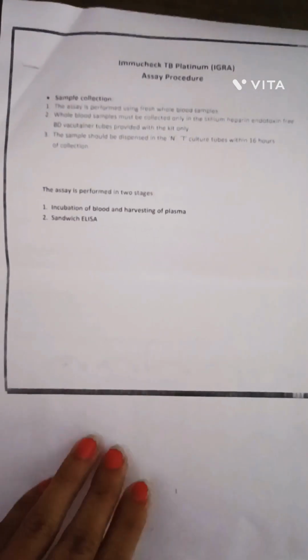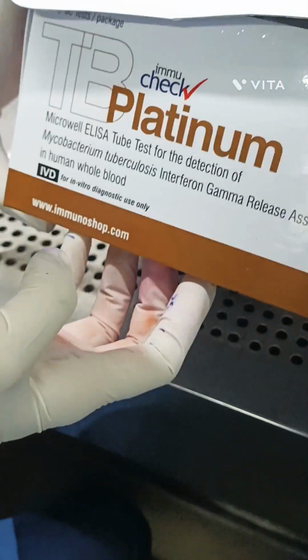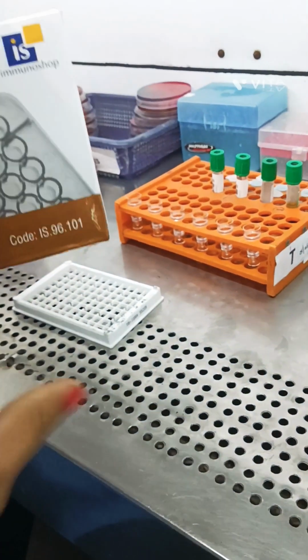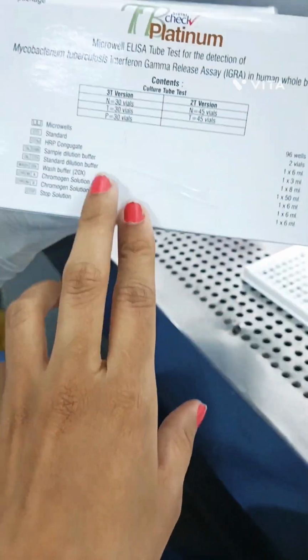So today I will discuss TB Platinum, what is the principle of TB Platinum, assay procedure and interpretation of the results. So what is TB Platinum? TB Platinum is based on the principle of IGRA, interferon gamma release assay. It is quantitative and checks for TB infection and TB disease.